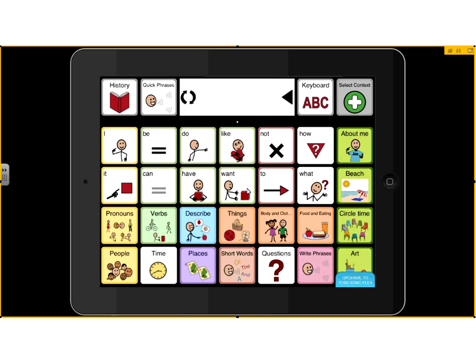The ones that speak or that start building vocabulary for us are the ones that are in white and then outlined in a different color. You'll notice several different colors here. These are color coordinated using the Fitzgerald Key for memory. So what we'll see is that green indicates verb, blue indicates description, orange indicates things or nouns, purple indicates places, and so that's an underlying thing throughout the use of this to help people put associations together a little bit better.